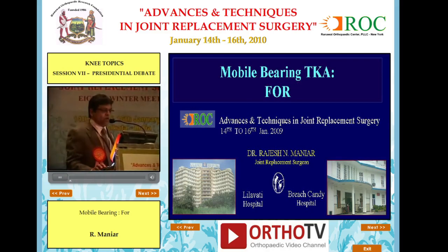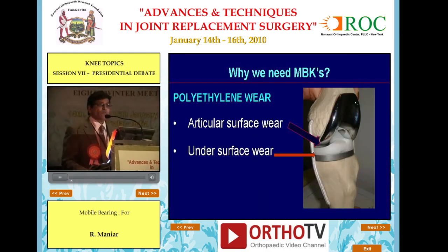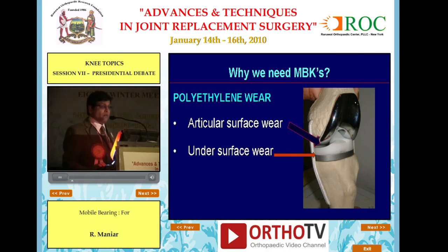Mobile bearing total knee arthroplasty. Why do we need a mobile bearing knee? That's because of the issue of polyethylene wear, both at the articular surface and at the undersurface.